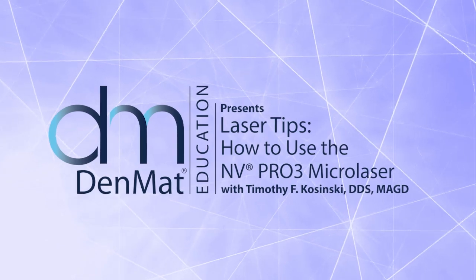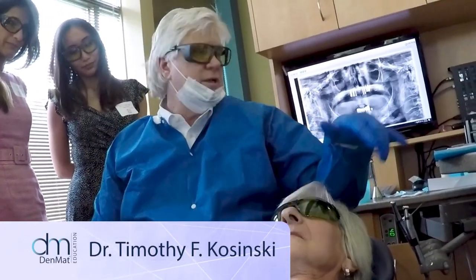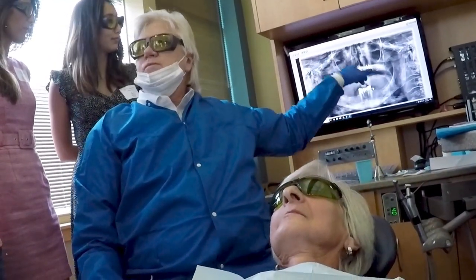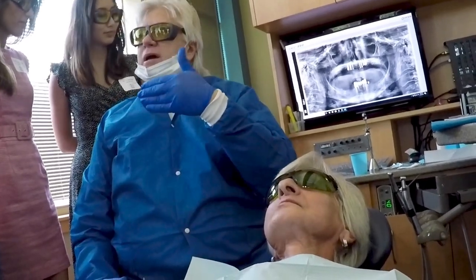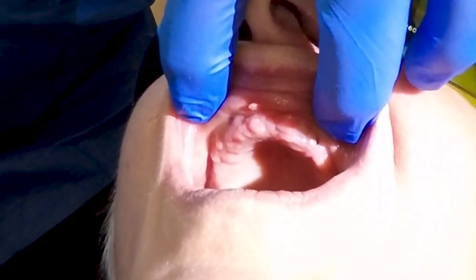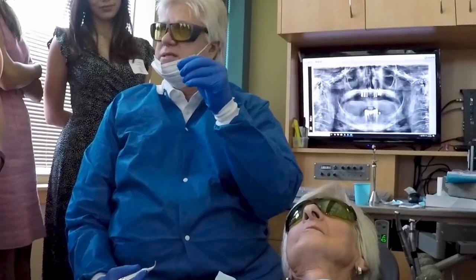The doctor anesthetized one side and put a little topical in the denture on this side. We have seven implants, and to expedite things and respect your time, I'm going to use the laser on the side that we just had topical. On the other side, since we don't have a tissue punch, I'm going to use a scalpel.